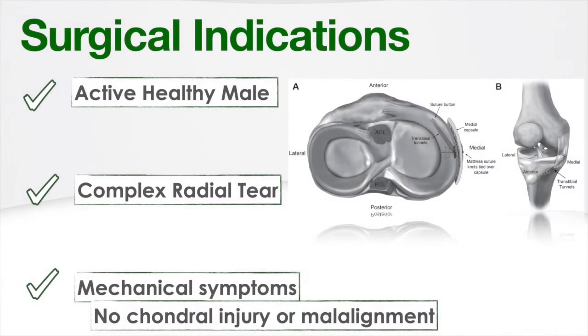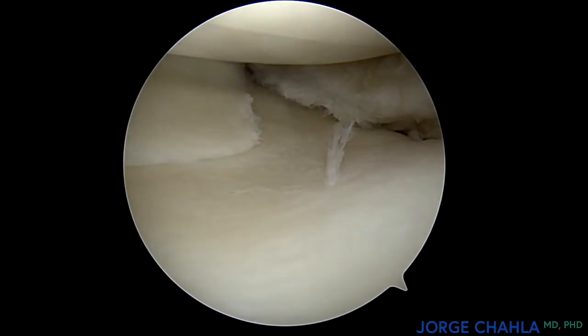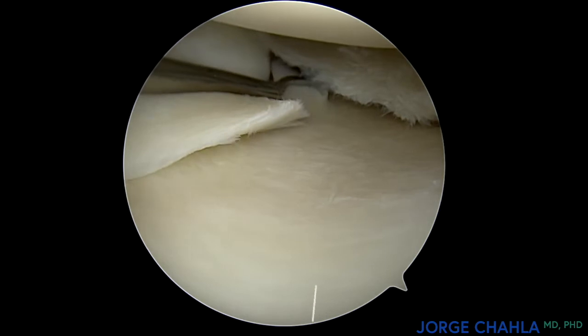Given his symptomatic presentation and imaging evidence of the tear, combined with his active lifestyle, he was indicated for arthroscopic repair of his meniscal tear. A combined horizontal mattress repair with transosseous augmentation was planned due to the biomechanical superiority of this construct as evidenced in the literature. For this technique, standard diagnostic arthroscopy is performed to confirm tear anatomy.